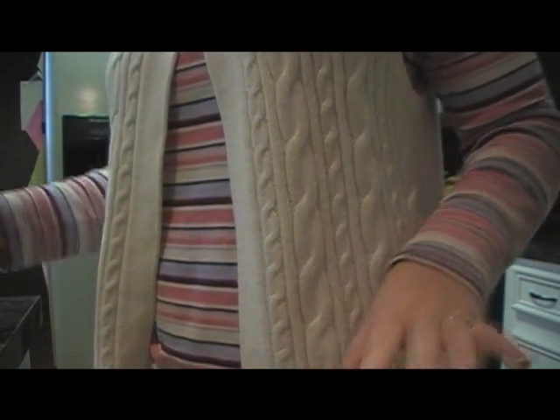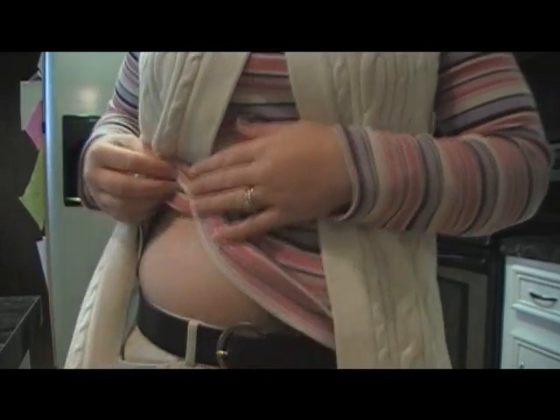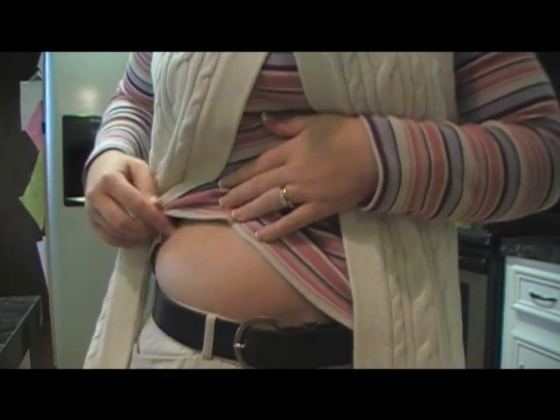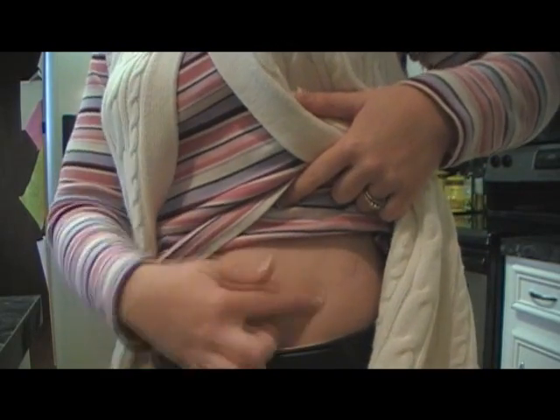I'm going to move the camera a little bit closer so you can see where I'm putting it on my stomach, so you can see up close what I'm doing. This is where the old site was, right here. I'm going to put it over here now.